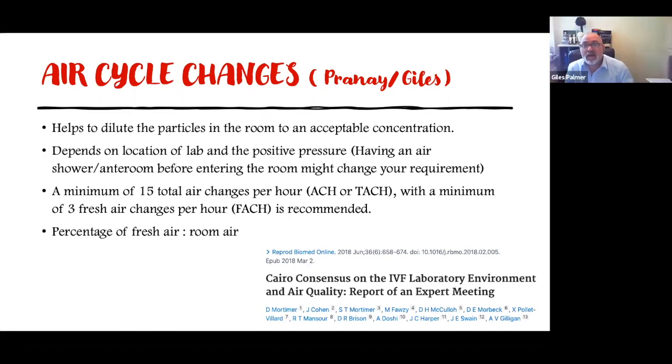Sure. If I may add, if there's one thing you want to take away, I think, it is to read the Cairo consensus. It leans heavily on the work that Estevez has done, who has been leading this field for a long time. And I truly think that IVF clinics have to move into the biotech arena, if you like, and take on these clean concepts. They are aspirational benchmarks. Obviously these things can't happen overnight, but they do show the difference, especially with VOCs, between these new types of labs and the old established labs, and how low the VOCs can be.